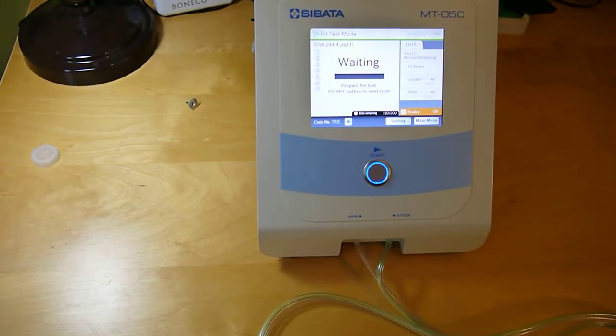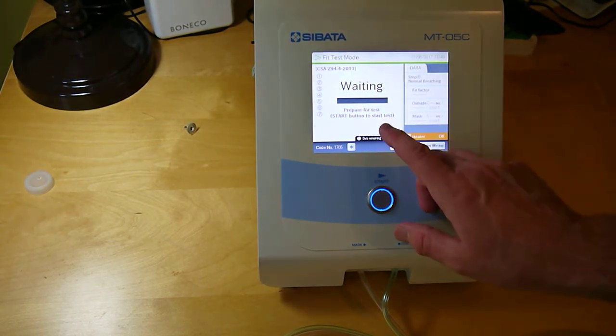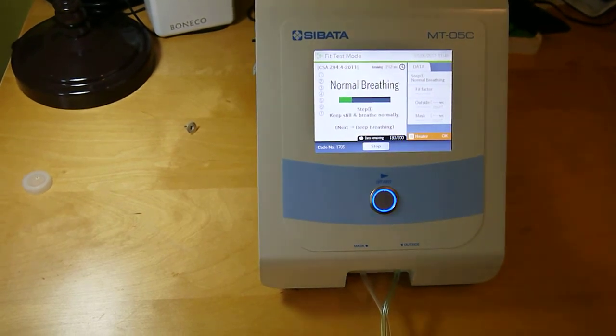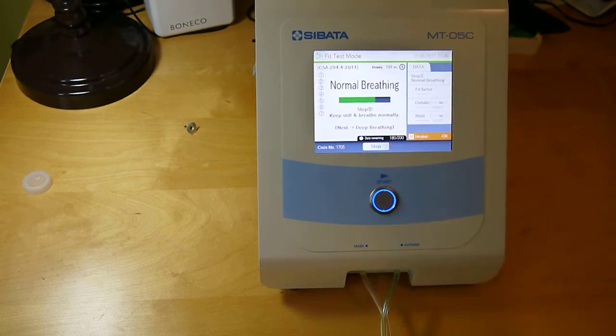Once they've got the respirator on and they're ready to start, the screen says 'waiting, preparing for a test — press the start button.' Coach the person through each step. Step one is normal breathing, and the next step will be deep breathing, as if they're walking upstairs or laboring a bit.